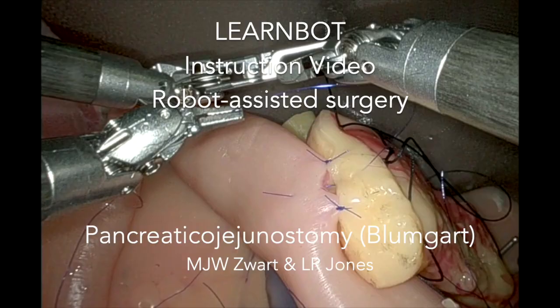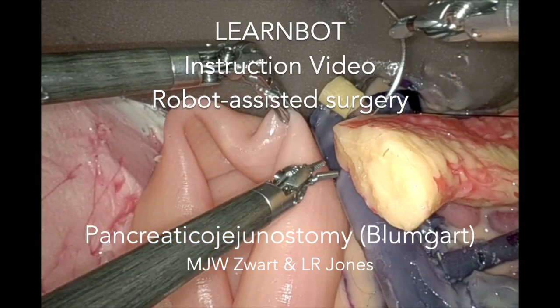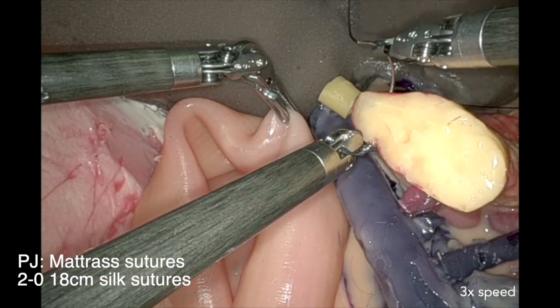Welcome to the instruction video of the Lernbos pancreatic jejunostomy, for the artificial organs made by the Heidelberg team.